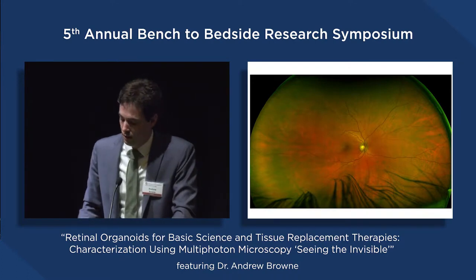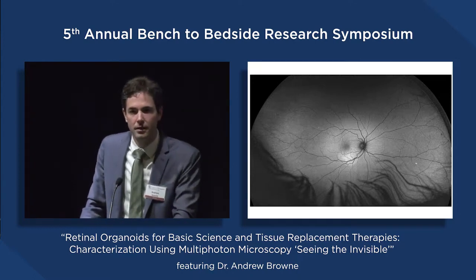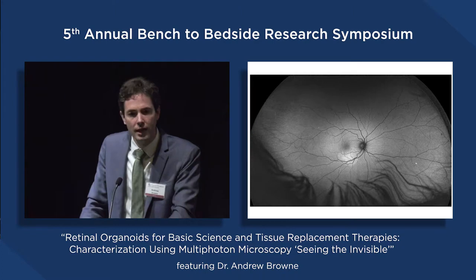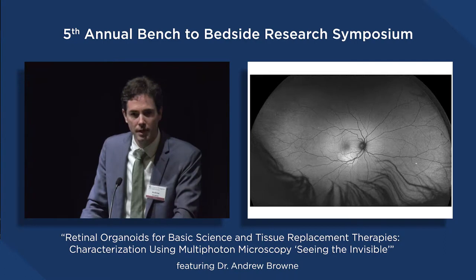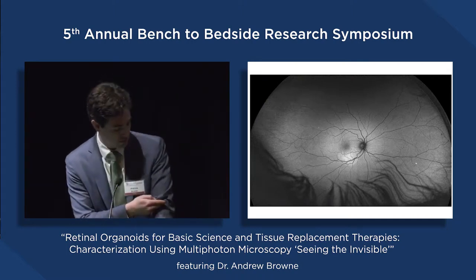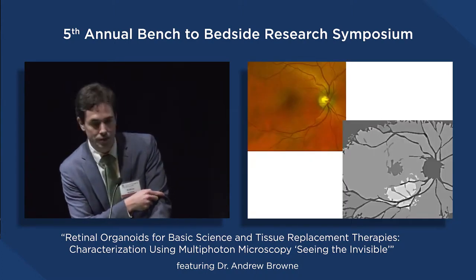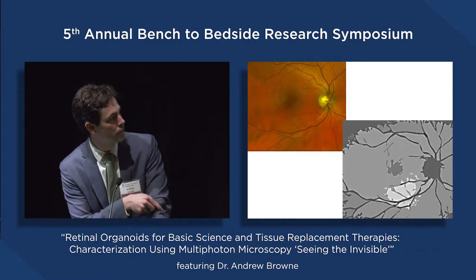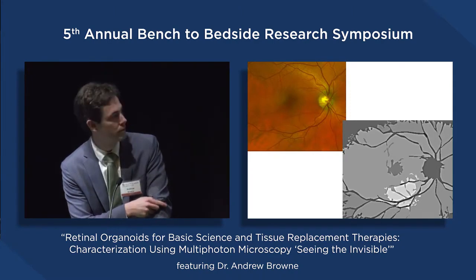If I take a different type of photograph, this photograph is the retina in a nightclub. Imagine taking a black light from a nightclub and shining it on the retina and looking at the glow of the retina, kind of like a yellow t-shirt or a white t-shirt that looks like it's glowing in the nightclub. That's what this picture is. You've seen a couple of these today already in some of the talks that talked about AMD. If you look carefully at this picture, you can see that there may be something that's a little bit out of place down here. And if we zoom in a little bit more, you might even be able to convince yourself that you see something in this color picture over here, but it really is more apparent in the glow-in-the-dark autofluorescence image of the retina. And we can process that image and make it a little bit more apparent in case you can't see it on the projection here on the screen.